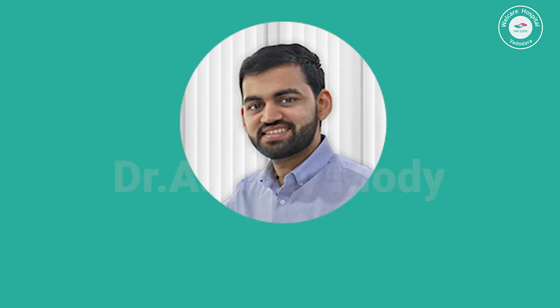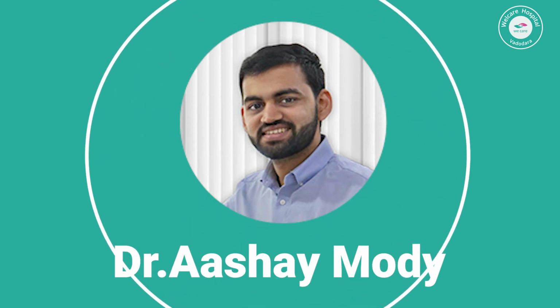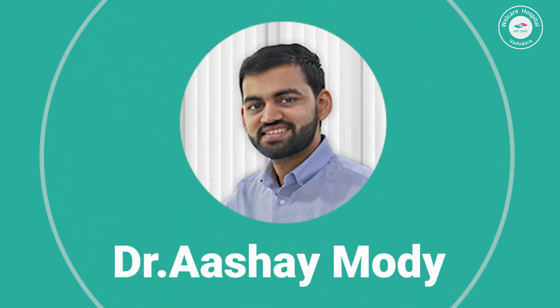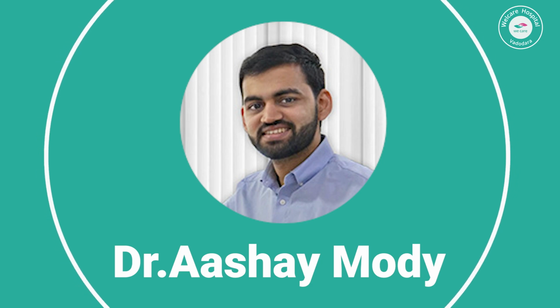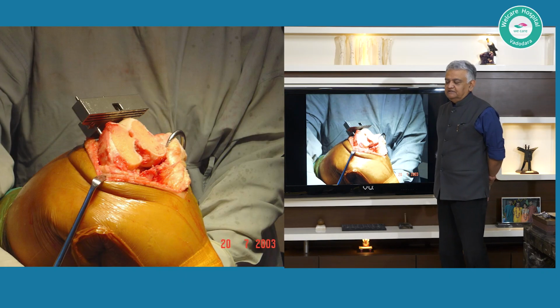So here we go. You have taken your cut. In an ideal situation, the blade has to go straight down to take the distal femoral cut. But if there is play in that system or the jig, is it safer to go with the blade touching the upper edge or the blade touching the lower edge?